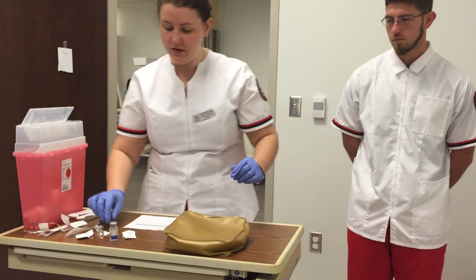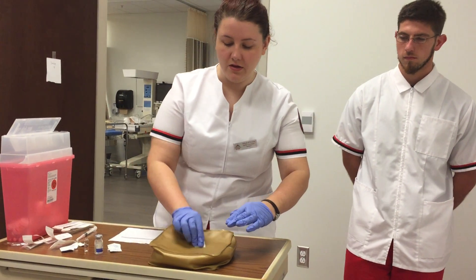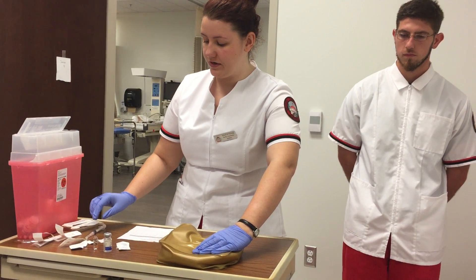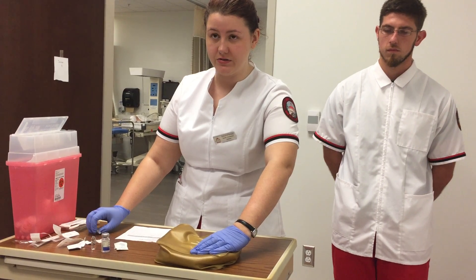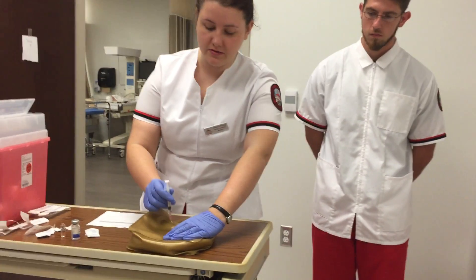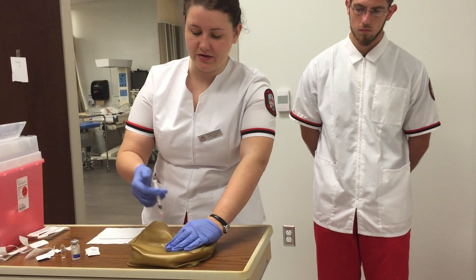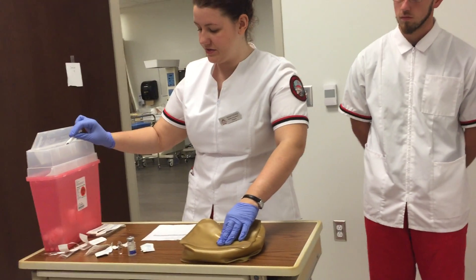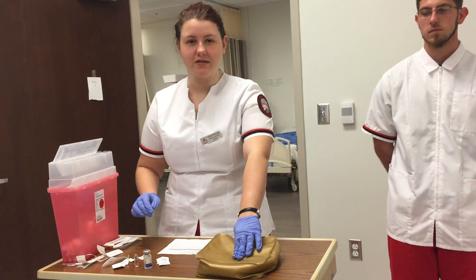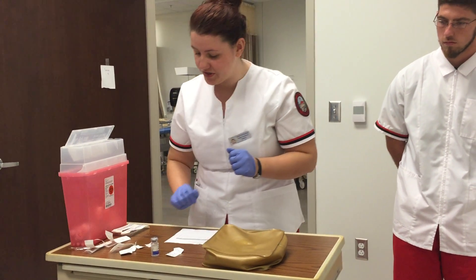Now for the subcutaneous injection, I'm going to do it in the left posterior back of the arm. I clean it with an alcohol pad, place my non-dominant hand, and pinch up. For subcutaneous you can use a 90 or 45 degree angle. I take my needle, pinch the skin, go down, inject it, and apply pressure. I throw it into the sharps container, apply pressure, and if the patient needed it I would put a band-aid on there.